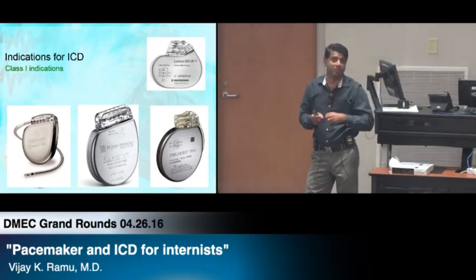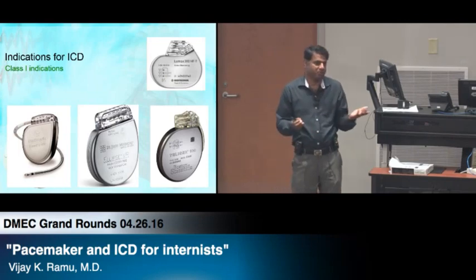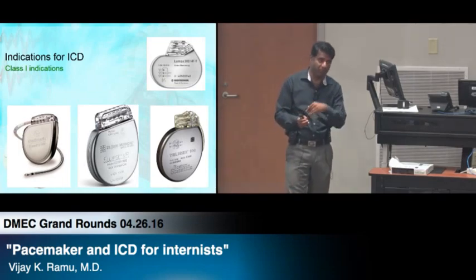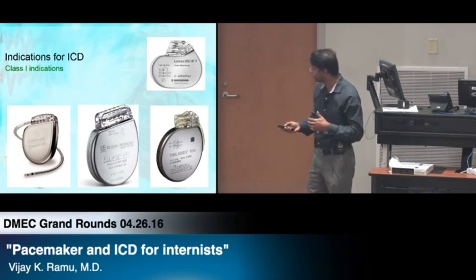Another common misconception is, why should we put in this device? The only reason I would not put it in is if the patient says, I'm a DNR, I don't want to be shocked. That's perfectly fine. Or if you feel the life expectancy is poor anyway, don't do it. But if you have a classic cardiomyopathy indication, please consider an ICD.